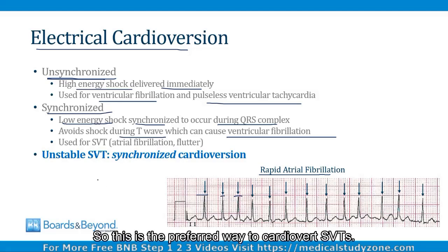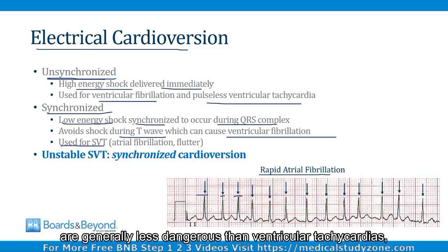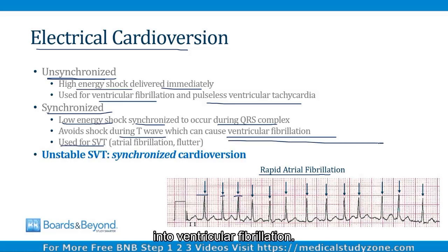So this is the preferred way to cardiovert SVTs. The reason is supraventricular tachycardias are generally less dangerous than ventricular tachycardias, and you don't want to convert them into ventricular fibrillation.